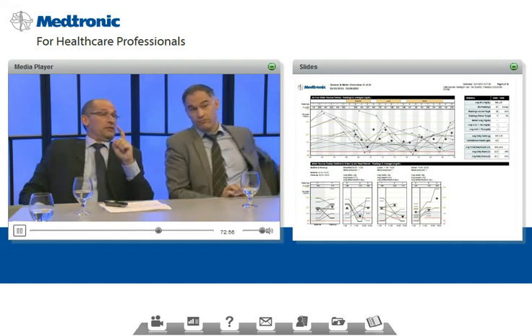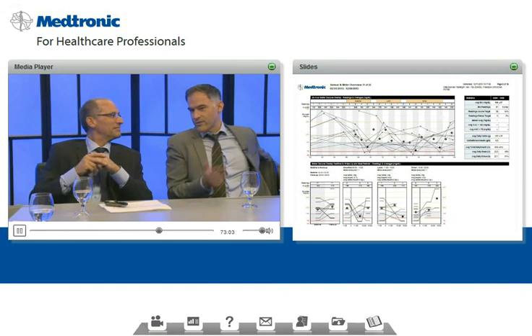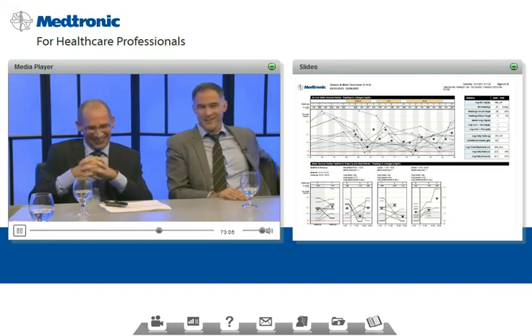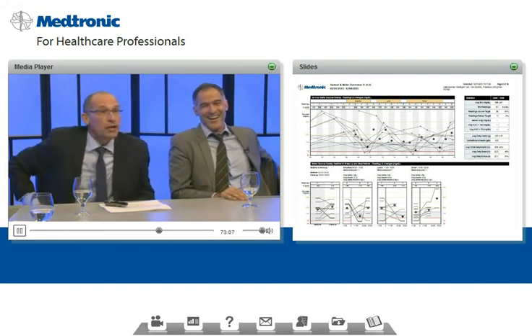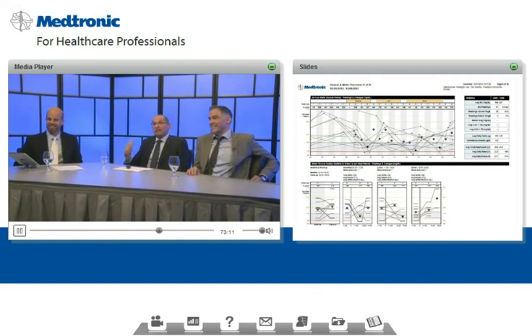So the question is, is the post-dinner rise because he's omitting insulin or because the plan is bad? Well, if his plan is to omit insulin. Yeah, you have an answer for everything. So I think the audience who's watching us were totally correct not to know which is the reason, because you don't have the data. You only know that he's measuring his blood glucose. So probably too few SMBGs is not the right issue and not the issue that you have to confront with this patient.